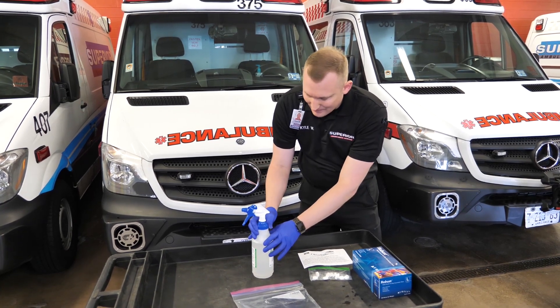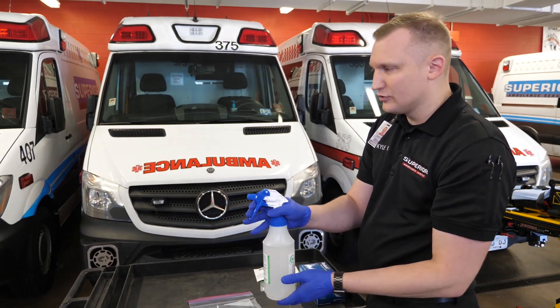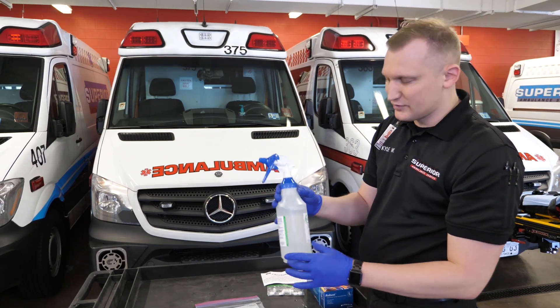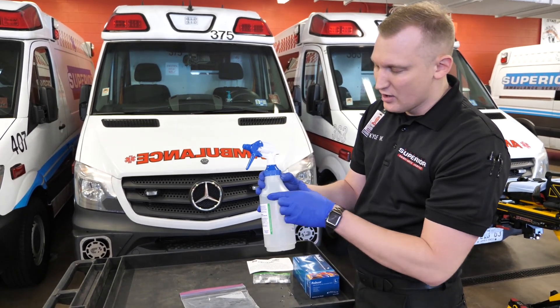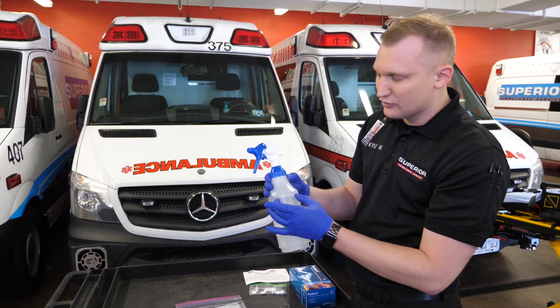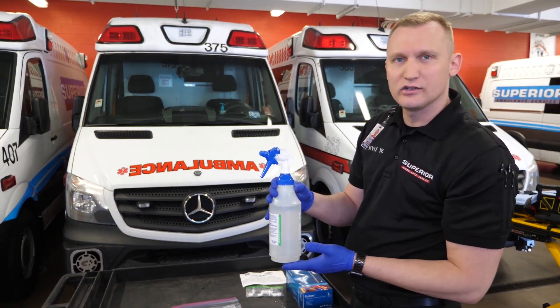Allow that to dissolve for five minutes and the solution is ready. We add our top. The nozzle comes closed — we want to make sure we open it to get a nice misting solution. Once the solution is made, we want to add a piece of tape here and put the date, as the solution is only good for five days. The next crew knows if the solution is past five days, they need to change out the solution.